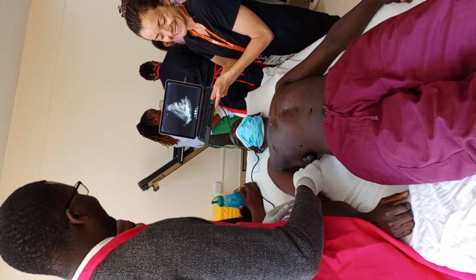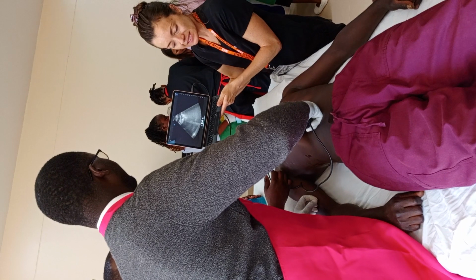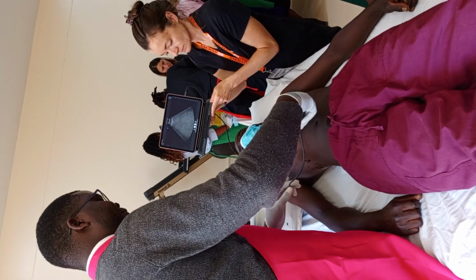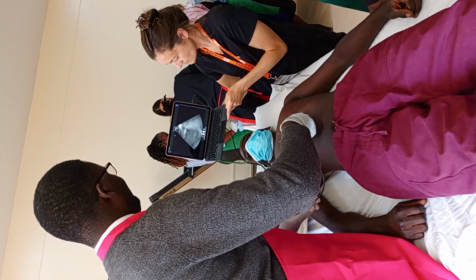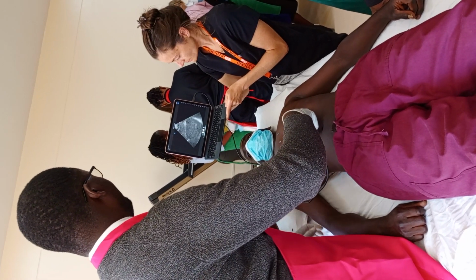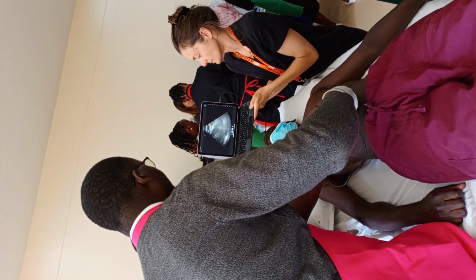Beautiful. All right. We need a lot more gel down here. There we go. There was a study they did on live volunteers, where they said that inserting an IO was painful, but using it was worse. So it was not so painful to insert, but it was more painful to use. Good luck.